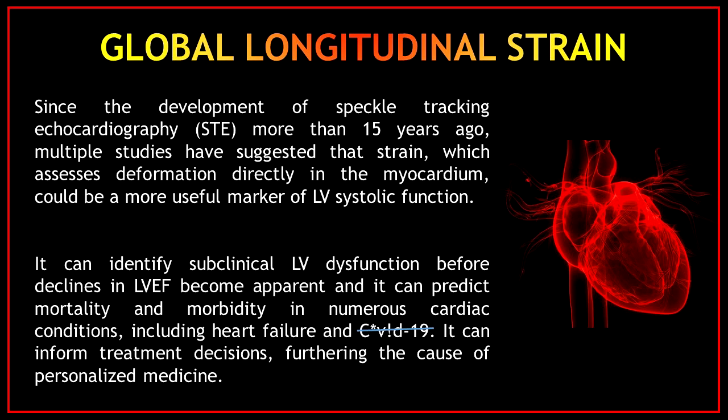Since the development of speckle tracking echocardiography more than 15 years ago, multiple studies have suggested that strain, which assesses deformation directly in the myocardium, could be a more useful marker of left ventricular systolic function.